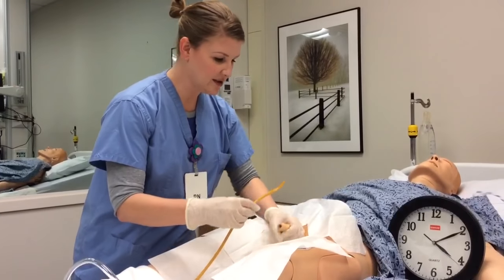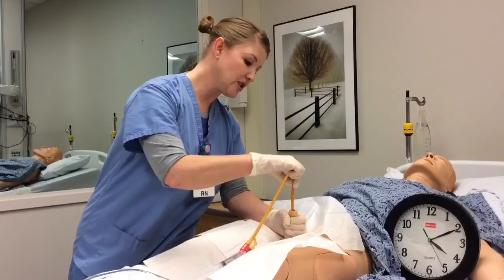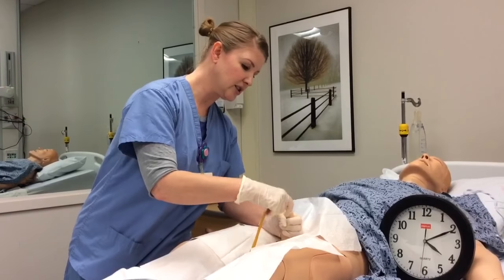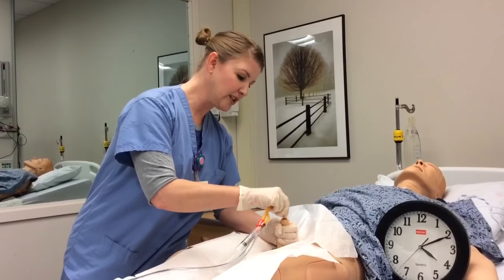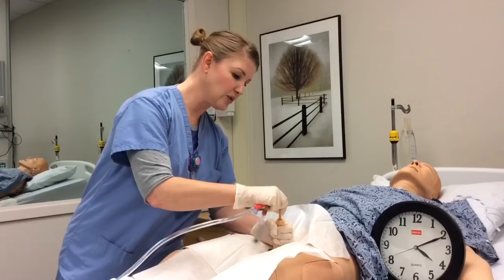We will hold the penis upright perpendicular to the patient and you will begin to insert the CUDE catheter. You will advance it. The normal anatomical shape of the male urethra is J-shaped, so you will advance the catheter all the way to the hub.